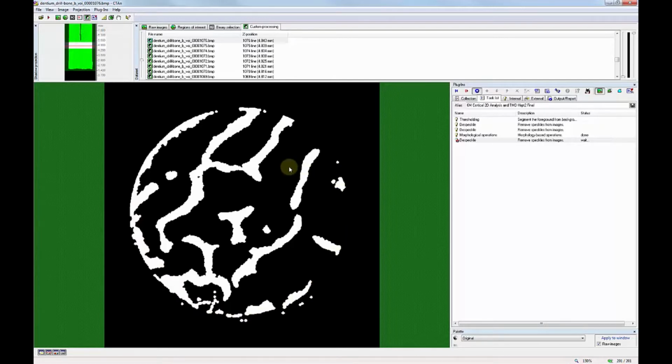So how do we do that? Well, the morphological open function basically first shrinks all pixels by the specified distance, in this case 3. So the edge of every sample, or every selected piece here, was shrunk by 3 pixels. Now anything smaller than 3 pixels was essentially erased. Then, after shrinking 3 pixels, it expands or dilates back out to fill out the full size. So in this way we preserve the edges of the bone, but we get rid of the ring.